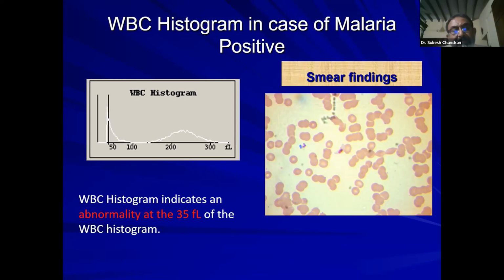If the patient has fever, highly think of malaria. You will look at the smear, you confirm malaria. But look at the histogram. It will tell you that there is some inclusion of the red cell which is there in the blood sample.